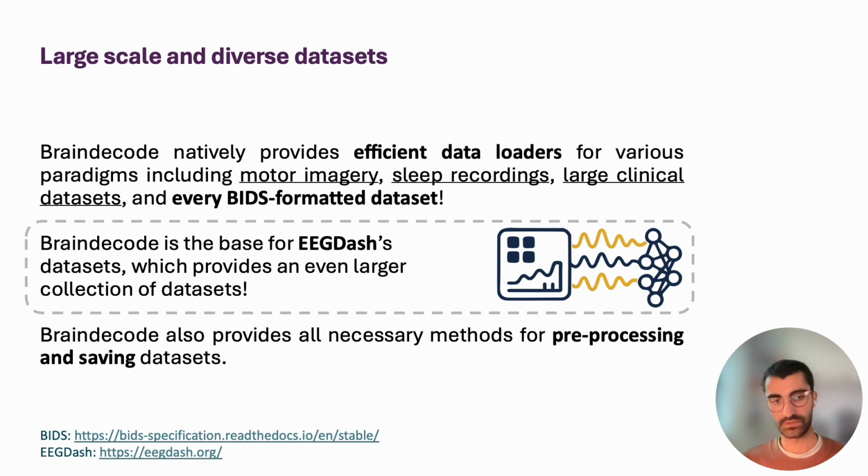Because thanks to this common format, everyone is able to load any BIDS data set with the same functions. And so in Braindecode, we support BIDS. And if you have a BIDS data set, you will be able to load it in Braindecode.